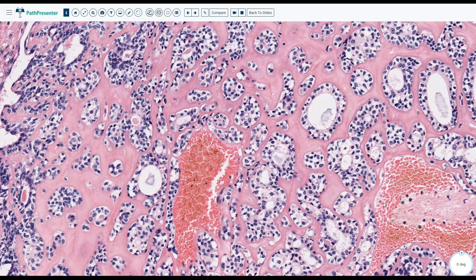Like this is the nature of the cell. Is the nature of this tumor monophasic or biphasic? So Mariam described it well, but I want to add one word. It is biphasic, exactly, and it has glands with clear cells.